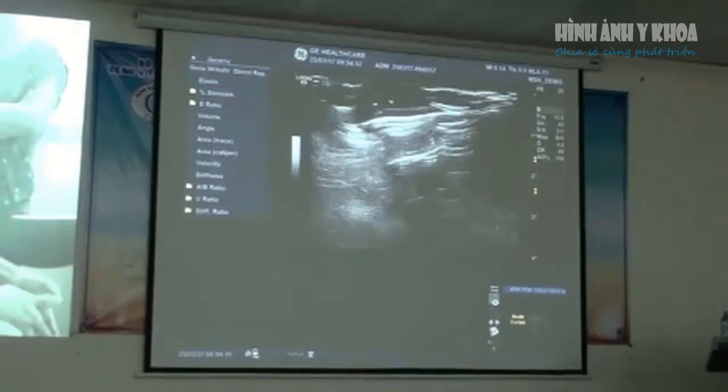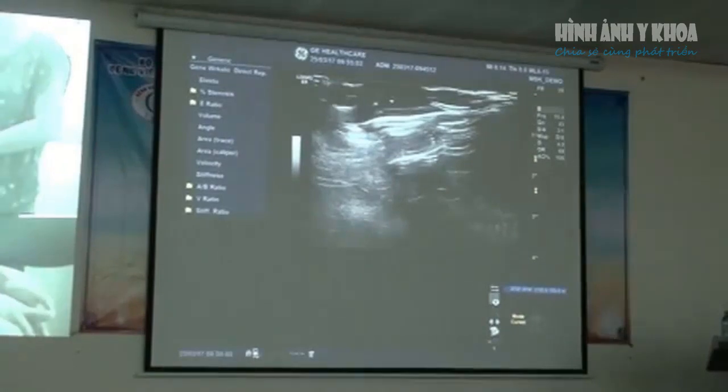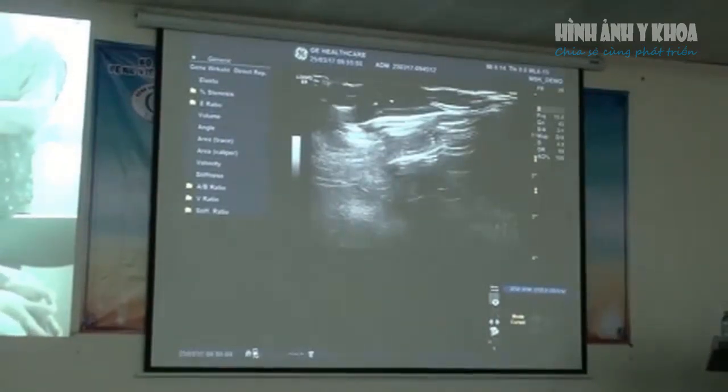And then I check the patient's range of movement. So I ask them to move their arm, and so I can assess myself if there's any restriction or pain with movement.